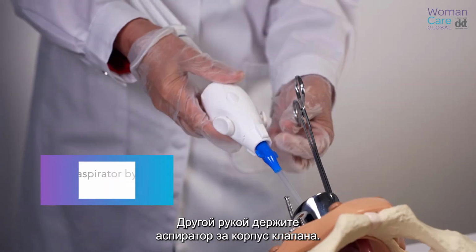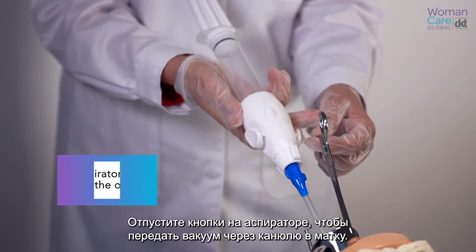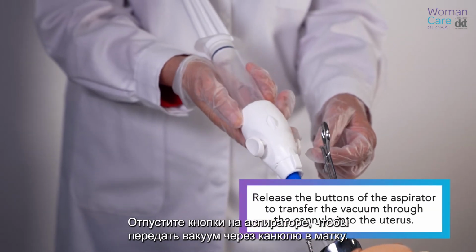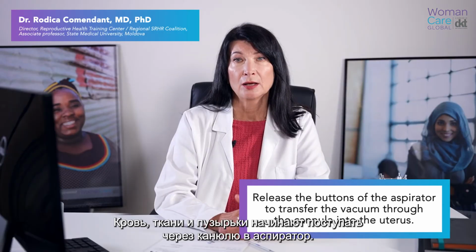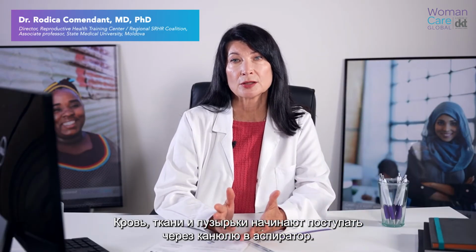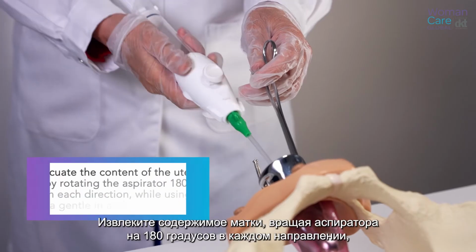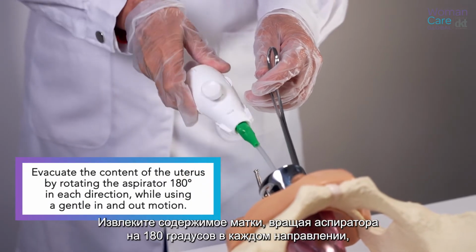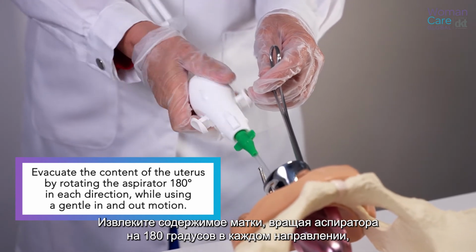With the other hand, hold the aspirator by the valve body. Release the buttons of the aspirator to transfer the vacuum through the cannula into the uterus. Blood, tissue, and bubbles should begin to flow through the cannula into the aspirator. Evacuate the content of the uterus by rotating the aspirator 180 degrees in each direction.